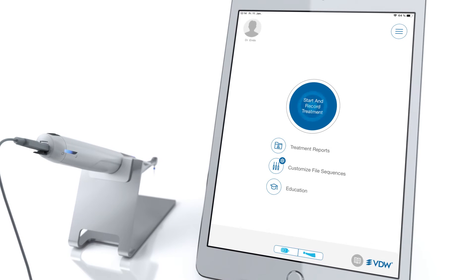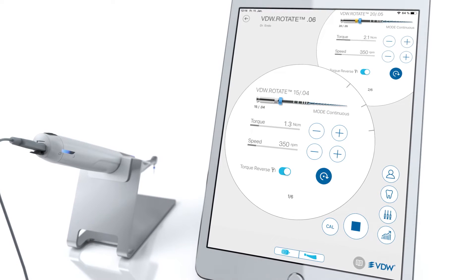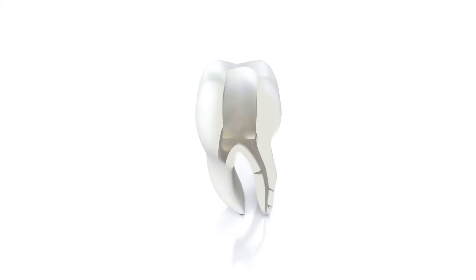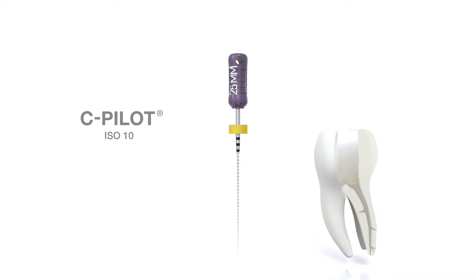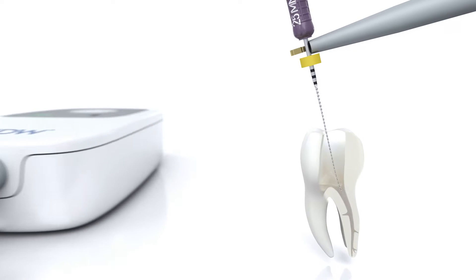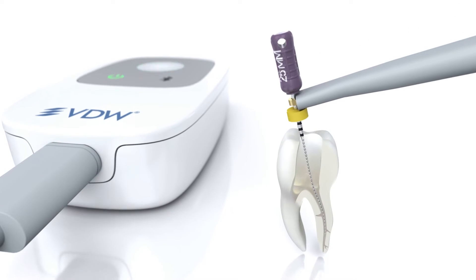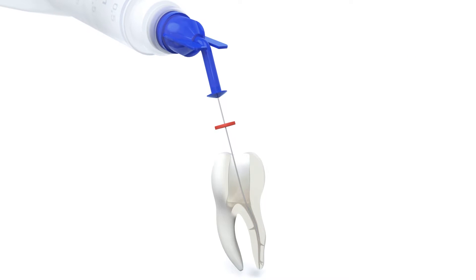Before you start working with VDW rotate instruments, use a preoperative radiograph to estimate the working length and prepare a sufficiently sized access cavity to reveal all root canal orifices. Scout the coronal two-thirds of the canals with an ISO 10 C pilot file, then determine working length using an electronic apex locator. Confirm patency and irrigate the canal.